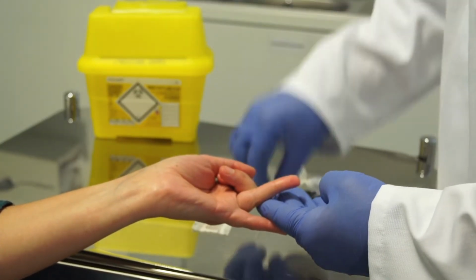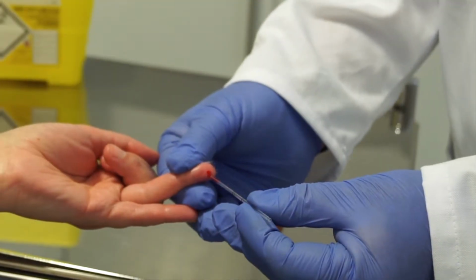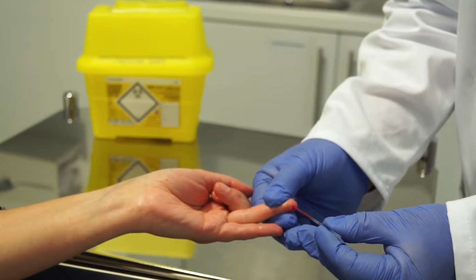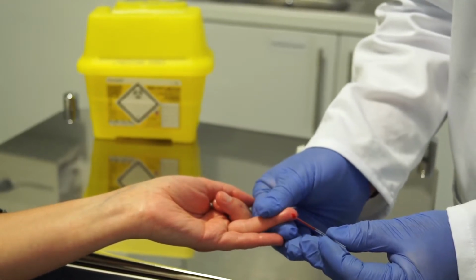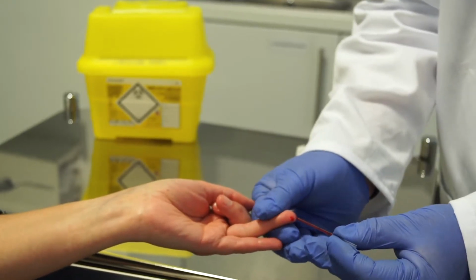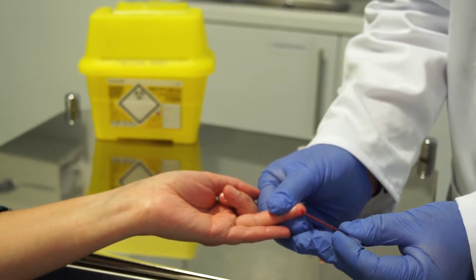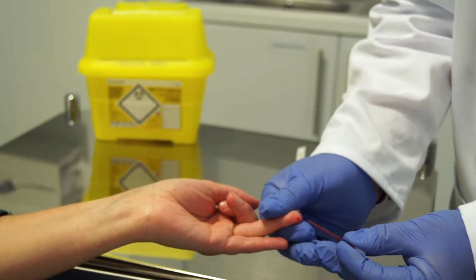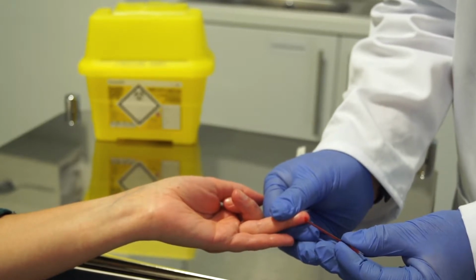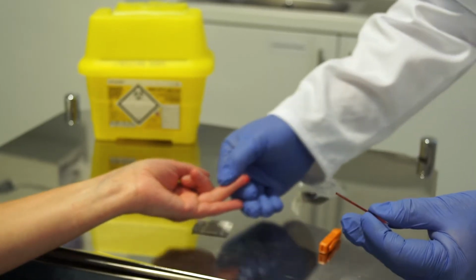Wipe away the first drop of blood with a cotton ball. Use a capillary tube to collect the blood sample. Fill the tube by holding it horizontally against the puncture, drawing the blood out by gently squeezing the finger. Try to avoid letting any air bubbles form inside the tube. Alternatively, the patient can directly drop the sample into the well of the test cassette.